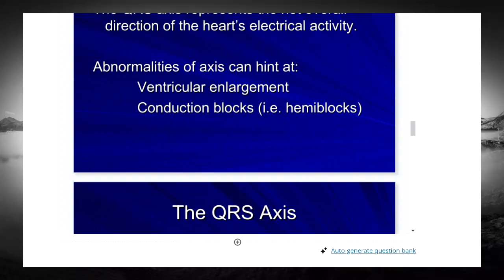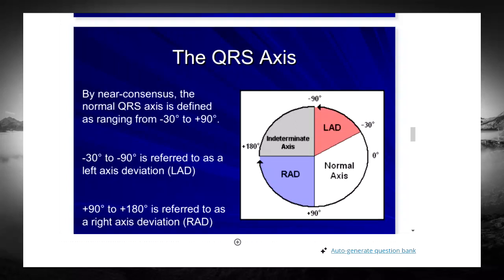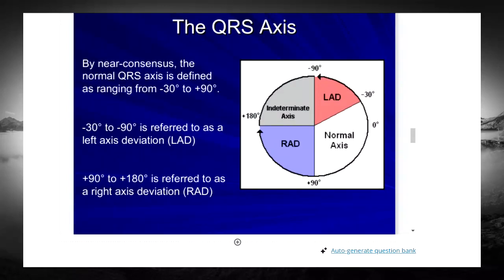We'll use it this way. So look, we're going to use this to show you where the numbers are, right? So remember, lead one goes all the way across, and I'm going to go back to it further, but I just want you to see where we're determining things.